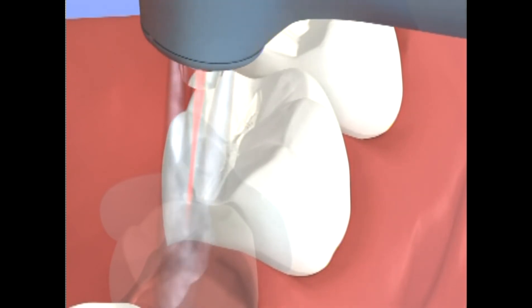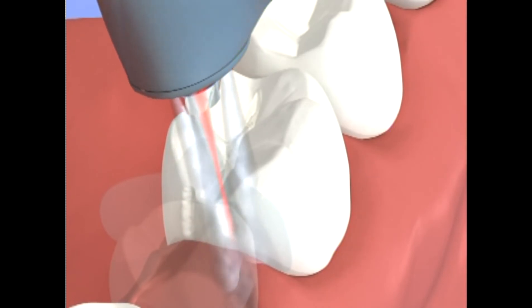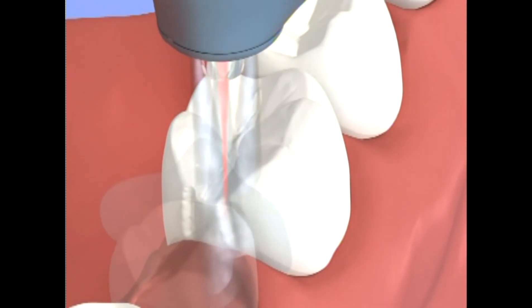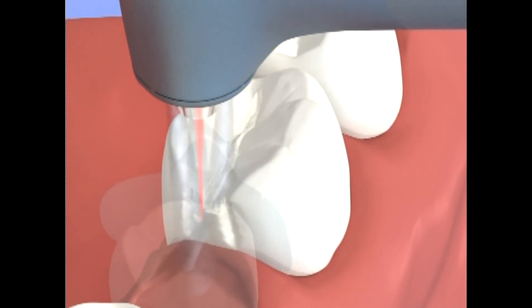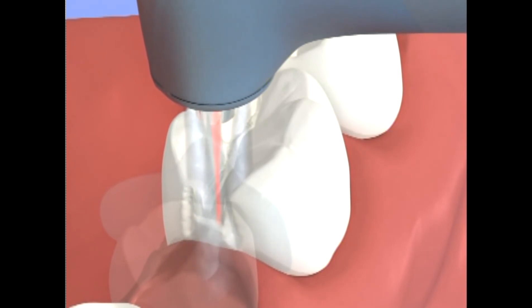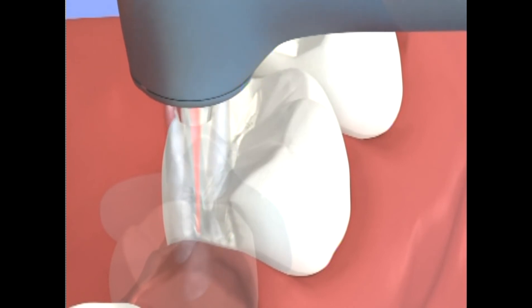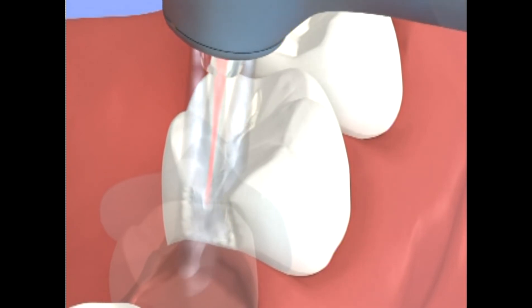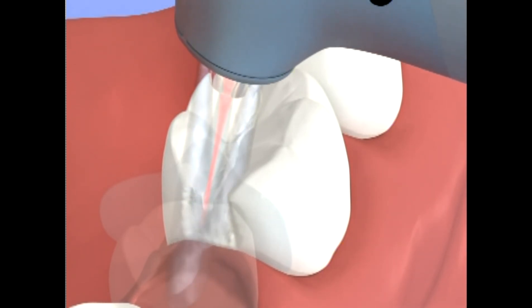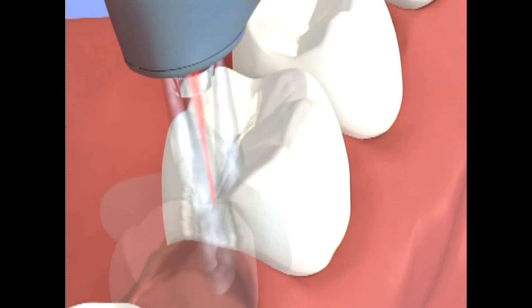To prepare the interproximal surface, start at the marginal ridge until you clear the contact with the adjacent tooth and remove the decay. Do not use a pendulum swinging motion like with the drill. Use a side-to-side motion from the buccal to lingual surface, moving in a straight line across and down. To widen the preparation to reach the decay, use the handpiece at a slight angle. To transition from the interproximal to the occlusal surface, gradually slope around the cusp and then into the groove.